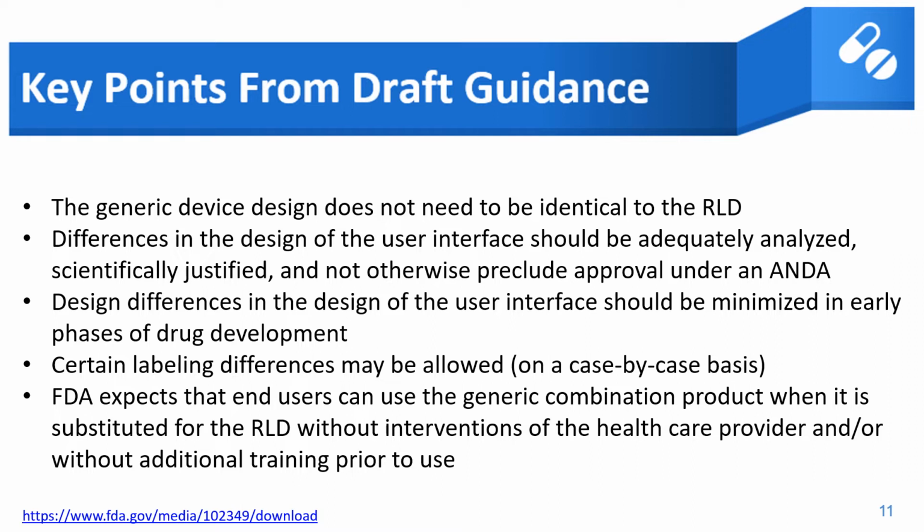There are certain labeling differences that would be allowed, but these are considered on a case-by-case basis. The expectation is that the end users will be able to use the generic combination product when it is substituted for the RLD without the intervention of a healthcare provider and/or without additional training prior to use.